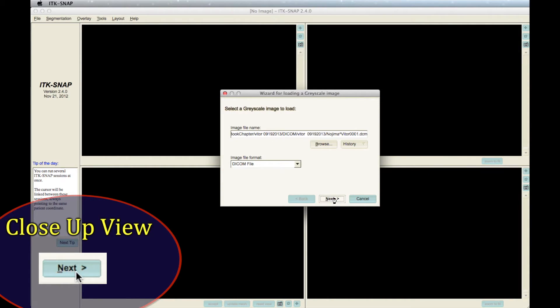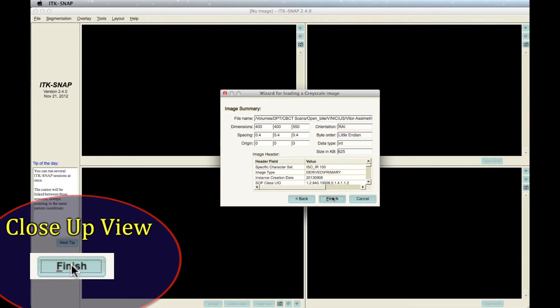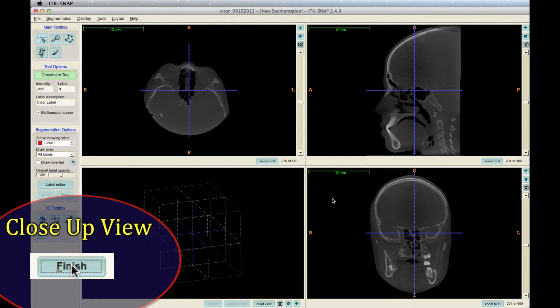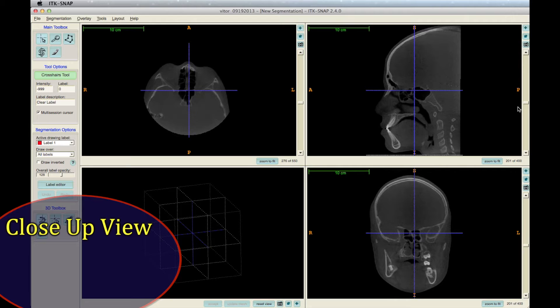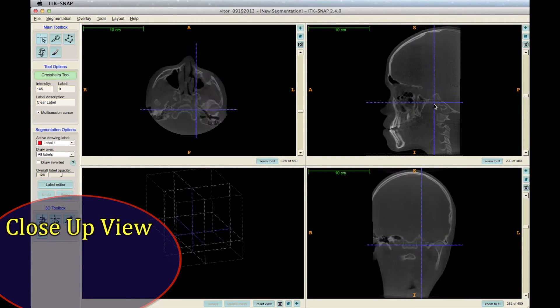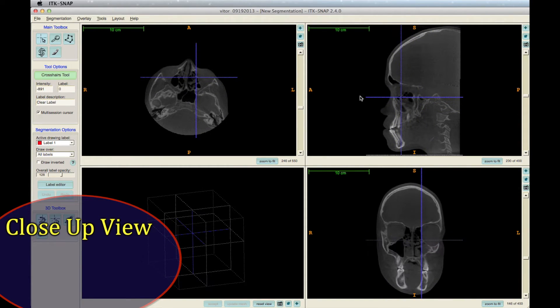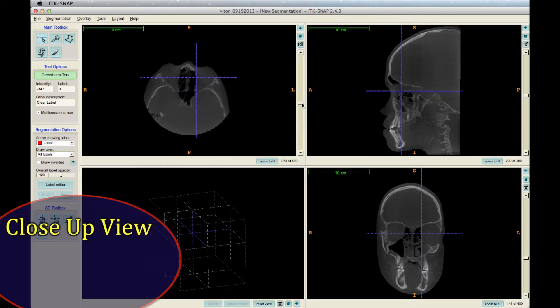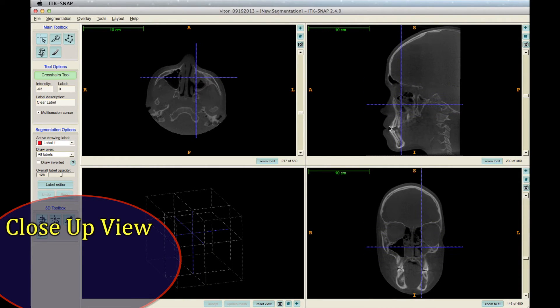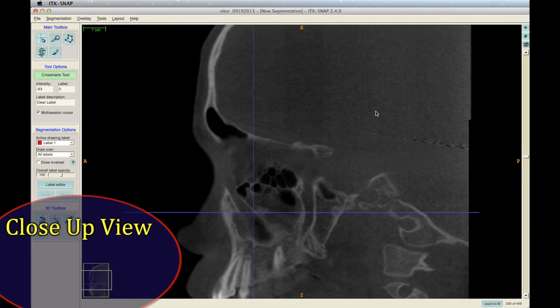Then click Next, Next, and Finish. In the initial window, you can navigate through slices, zoom in, and zoom out.